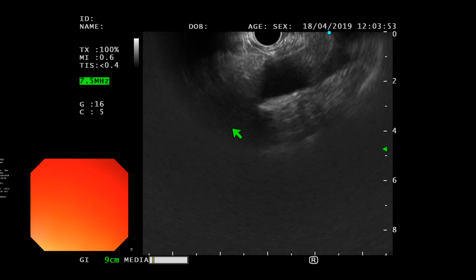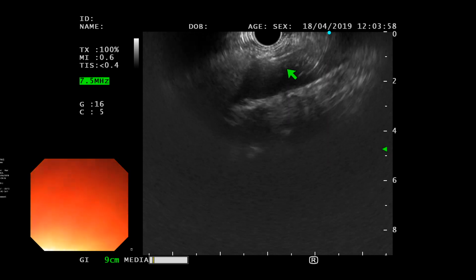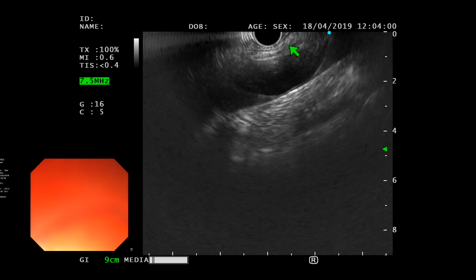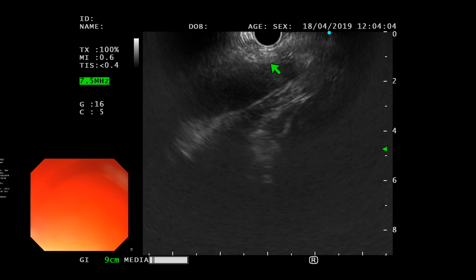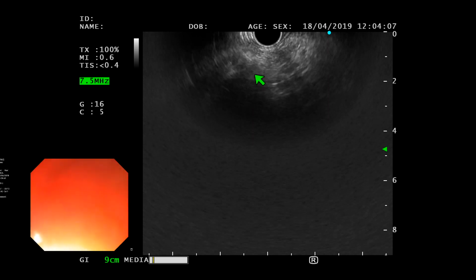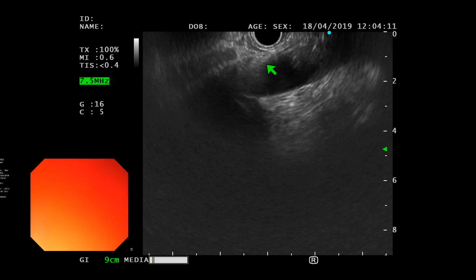Okay. So here's the aorta. Keep the aorta in view. Just stay there for a second. Okay, crus of the diaphragm here. And now if the crus is here, the branches are going to be lower down. So gently advance your scope, keeping the aorta in view. Just gently advance. There you go. That's it. Now pull.